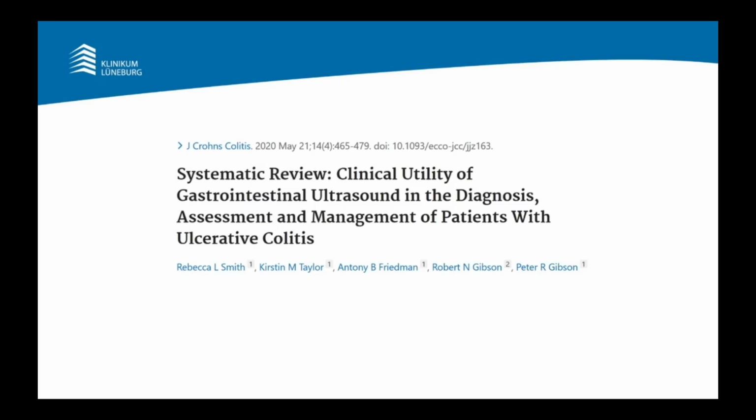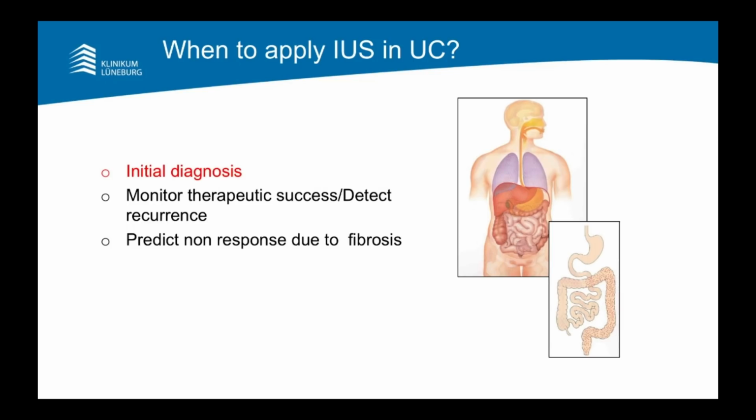However, that colleague has been wrong, or not wrong, but lots of data have since then evolved, and you can find a very nice systematic review by our Australian colleagues in JCC just published in May of this year. Now let's go into more detail. When to apply intestinal ultrasound in UC?